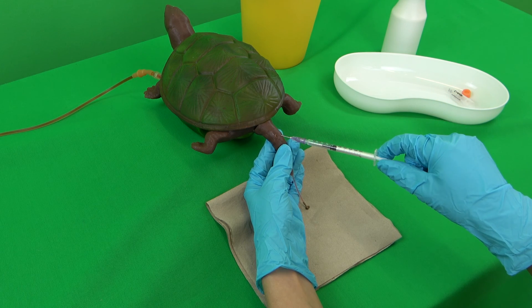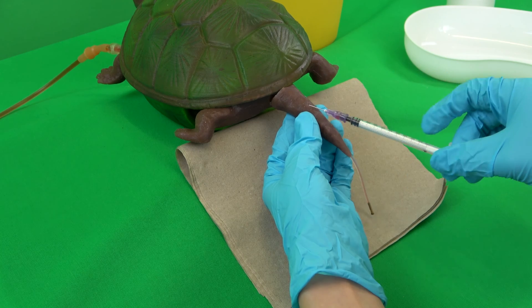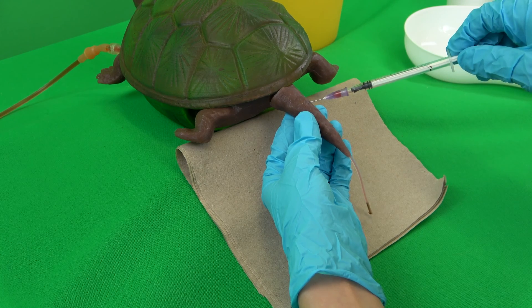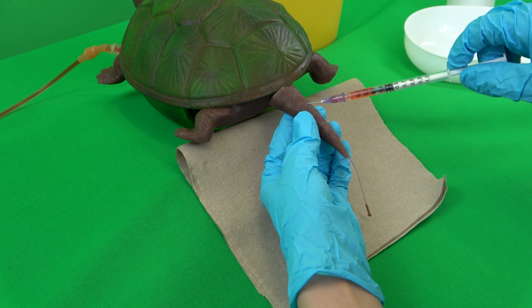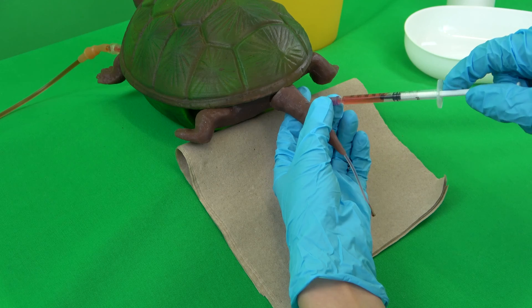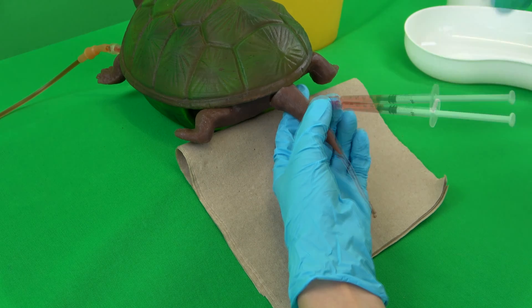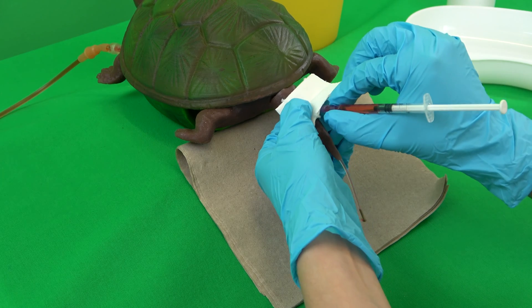Rotation and gentle movement laterally and dorsally of the tail help here. If blood is still not visible in the cone, the syringe and cannula must be removed from the animal's body. The cannula is discarded and another attempt is made with a new cannula. If the vein has been successfully punctured, the desired amount of blood is taken — in most cases at least 0.5 milliliters depending on the desired tests. A swab is then pressed onto the puncture site and at the same time the syringe with the cannula attached is pulled out.